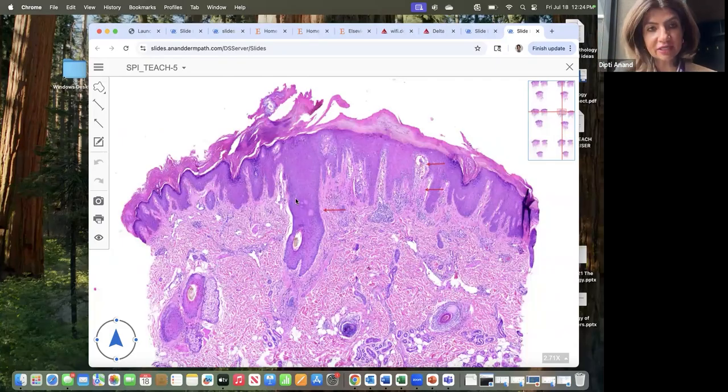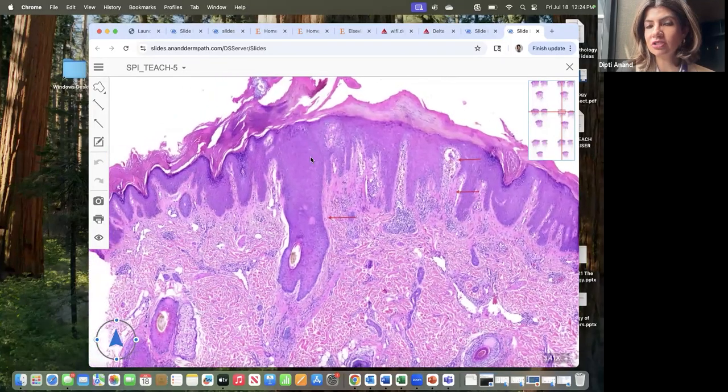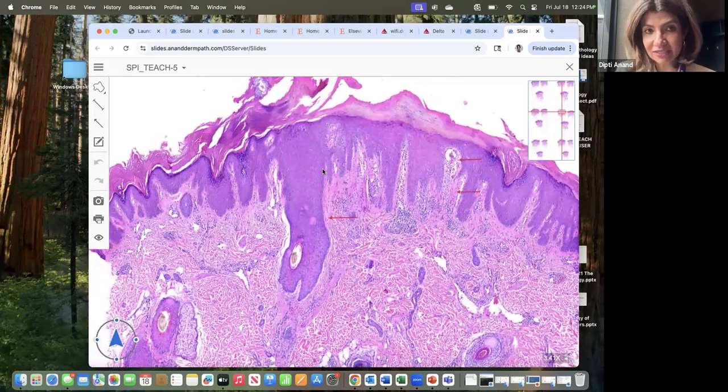You see these follicular hypertrophied infundibular units. You can see these thick hair follicles, these vertically oriented papillodermal fibers, and these vessels which are oriented perpendicular to the epidermis. So all these changes are classic for LSC or prurigo. This is a very important board entity. They will ask you to distinguish this from a wart, and you should know the hypertrophied follicular infundibular units, these stretched out vessels, and the dermal fibers which are oriented perpendicular to the epidermis. So that is LSC or prurigo.